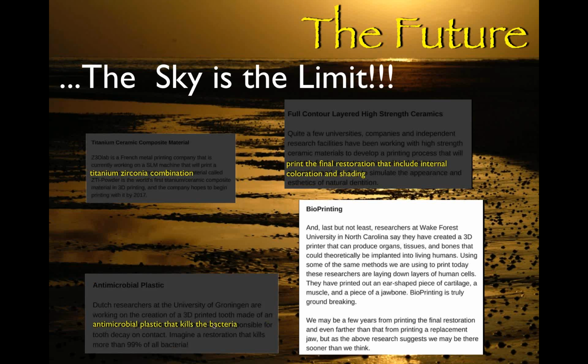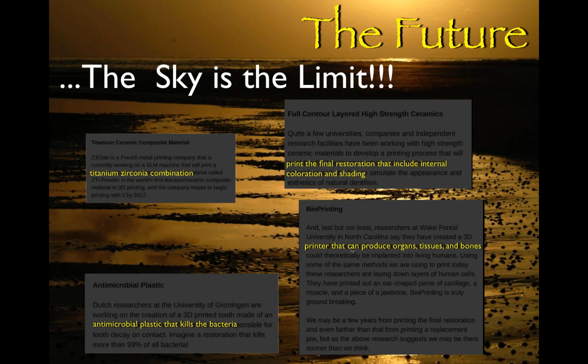Antimicrobial plastics that kill bacteria. Looking at these kinds of things, perhaps for temporaries and long-term temporaries in the mouth. And the bioprinting, which you're hearing about, where you can actually print human cells. They're printing ears, they're printing noses, they're printing all kinds of human tissue for transplant and for burn victims and cancer surgical victims, different things. And it's amazing, almost scary what this kind of technology brings to the table. It really is an incredibly exciting technology.